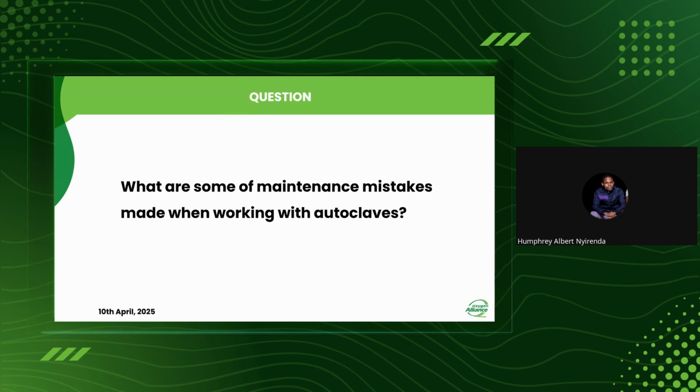And so that brings in negligence in conducting some of the preventive maintenance, where you have users questioning why you want to see this machine if it's just working as intended. So there is negligence of sometimes following the maintenance guidelines, where the manufacturer may specify that it has to be cleaned after 3 months due to some debris that sometimes occurs in these systems.